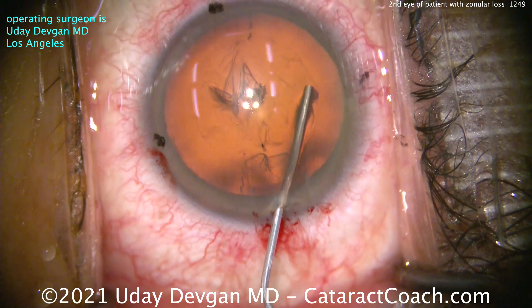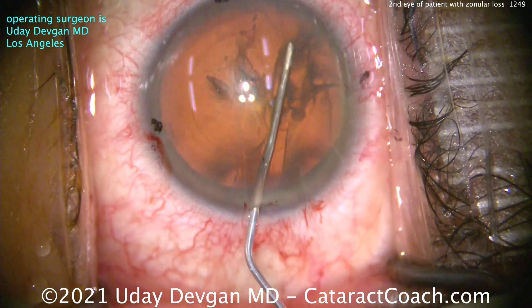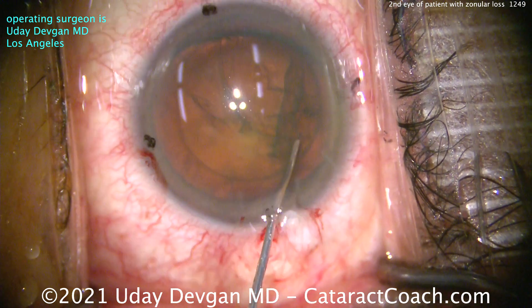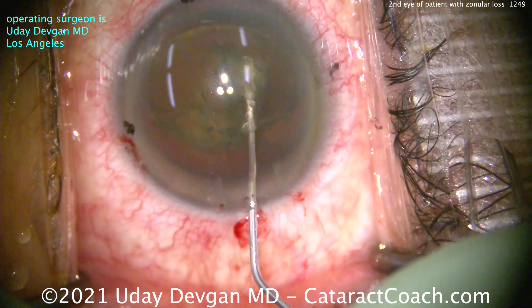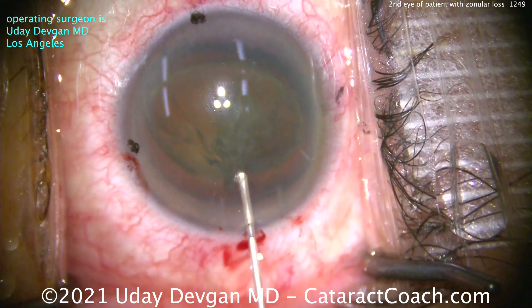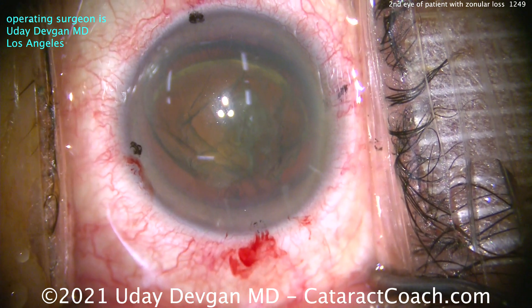So on this side we're going to be extra cautious. We're going to be extra cautious doing our hydrodissection — we'll watch carefully. The rhexis was a lot better on this side than the other. Let's see if we can get the endonucleus out of the bag — same technique as the other one. I want the endonucleus out, so I've hydrodelineated and have that epinuclear shell hold the capsular bag back away from me while I get the endonucleus out.